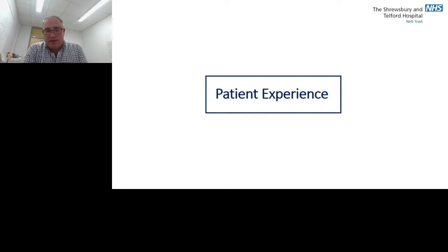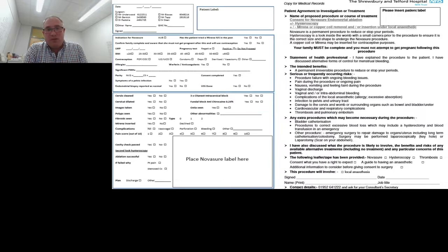That's generally the patient who won't tolerate a speculum examination at all. The vast majority of patients, more than 95%, would have a local anaesthetic NovaSure ablation. From our paperwork point of view, we try to standardise everything as much as possible.